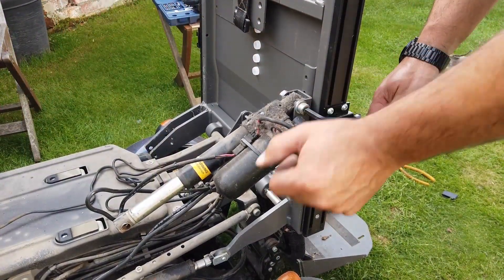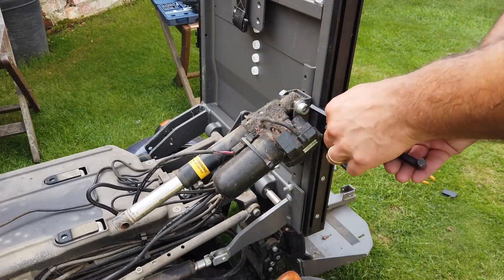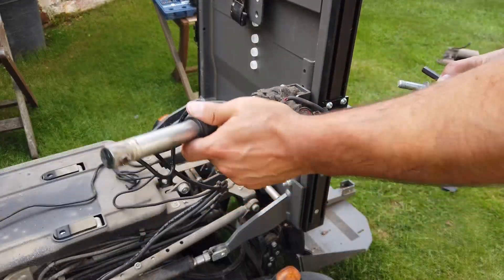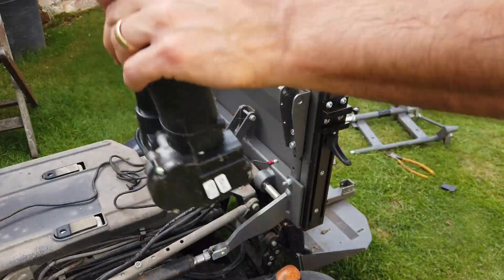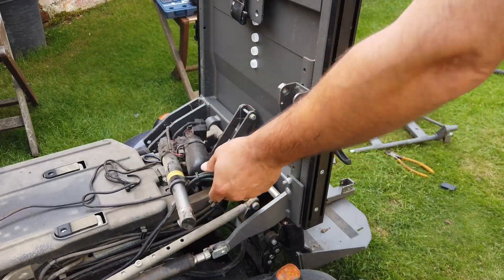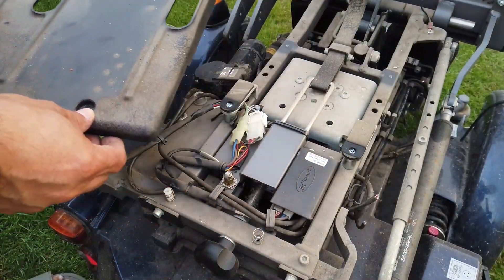Let's start working on getting that linear actuator out — those things are worth an absolute fortune, and not only that but they're really really useful. I'm thinking perhaps I could automate the opening and closing of the barn hatch on my new shed — that would be fun. What's also interesting about the seat base is it has a little micro switch on it so it knows if somebody is sitting in the seat.